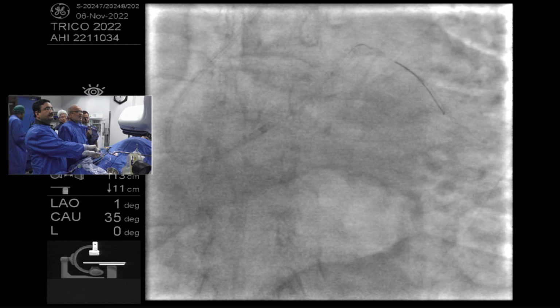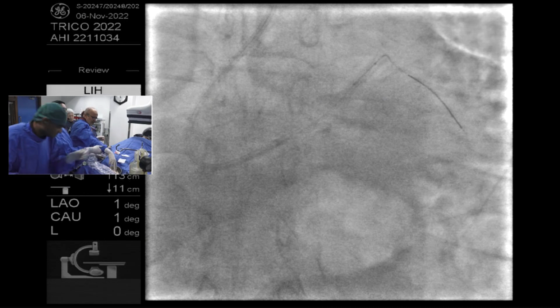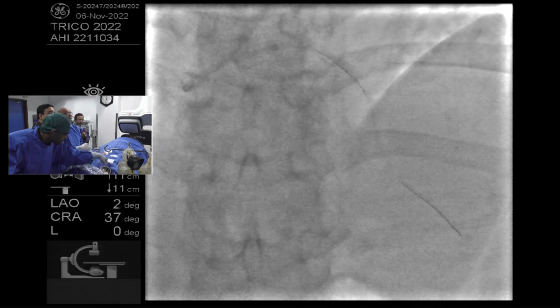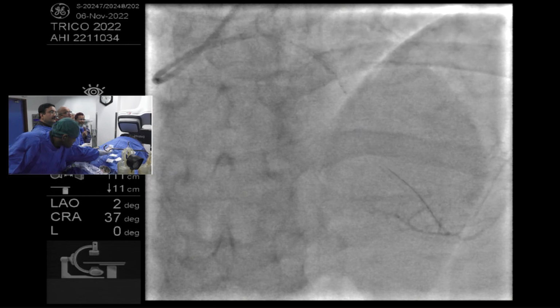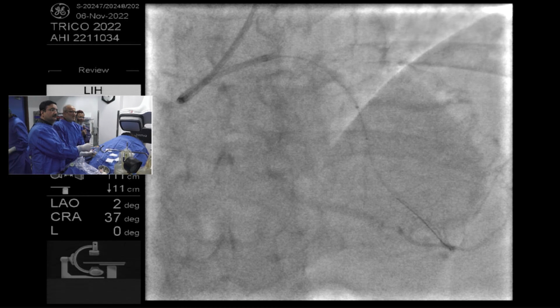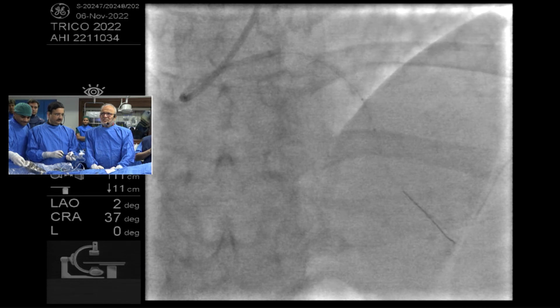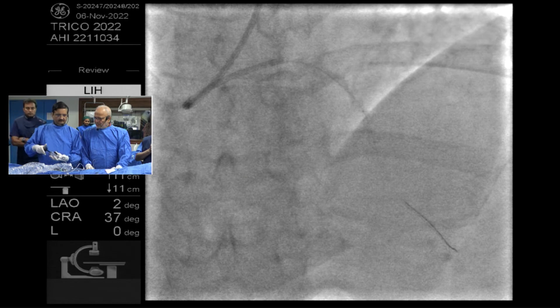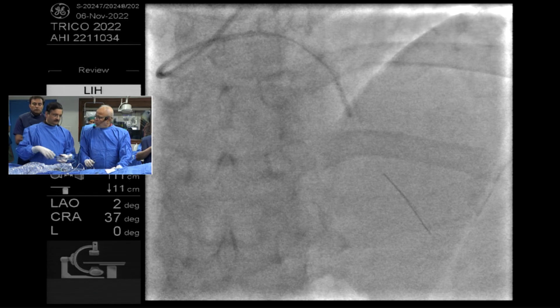I think before IVL, we used to use the cutting balloon all the time. That is what I am asking. The results were, I think, less ideal with the cutting balloon than IVL. We are expecting a better minimal stent area with IVL, absolutely, especially in circumferential calcium. It seems to be deep calcium as well, wherein cutting balloon won't be of so much use. IVL would be better in case of deeper calcium. With circumferential calcium, balloon IVL also works well.